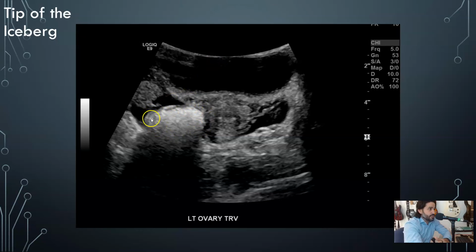If you use a higher resolution image, you may see the gut signature of the bowel. You can also wait, scan them a little later, and see if this is gone, because as you're scanning, this might not be actually peristalsing. So it can be very confusing. So just be aware of that.